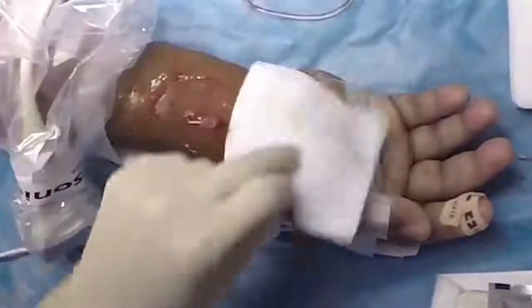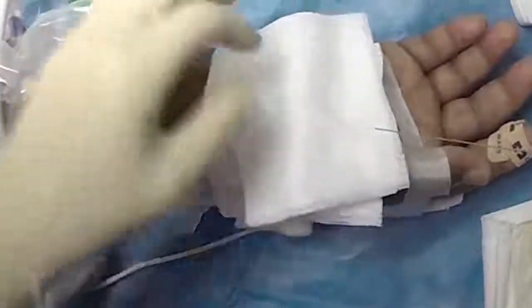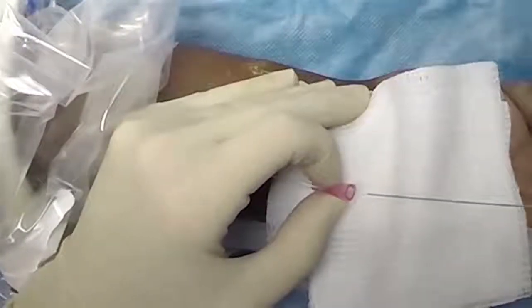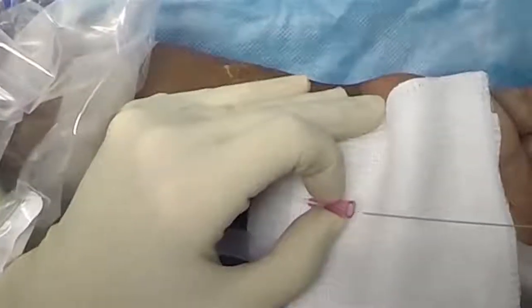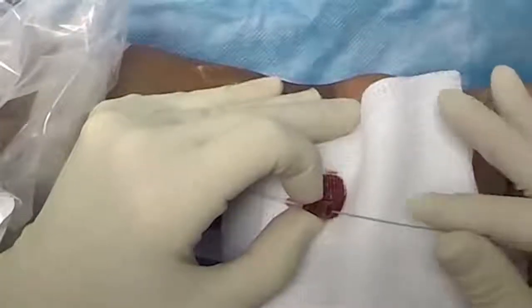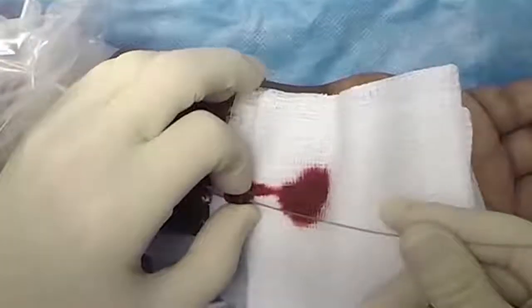Since the catheter is through and through the artery, slowly retracting the catheter should yield a situation in which the tip of the catheter has just passed through the far wall of the artery, while still remaining inside the lumen. Slow retraction until pulsatile blood flow is seen is key. Slow dripping blood without pulsatile flow usually indicates failure of this technique.